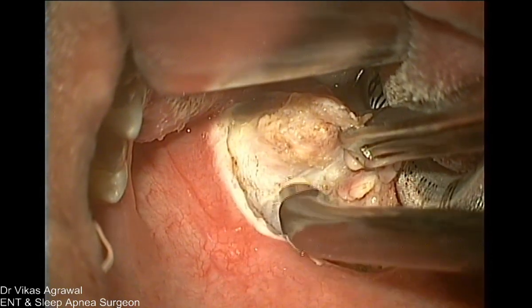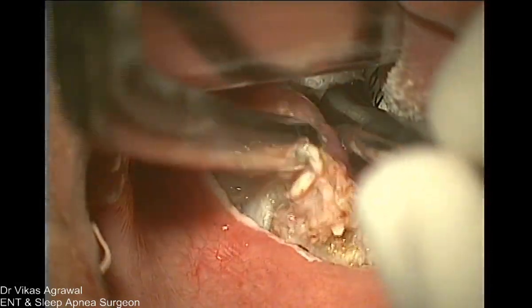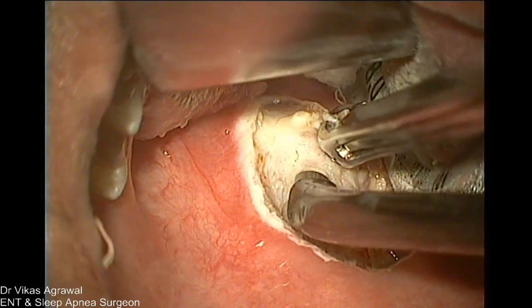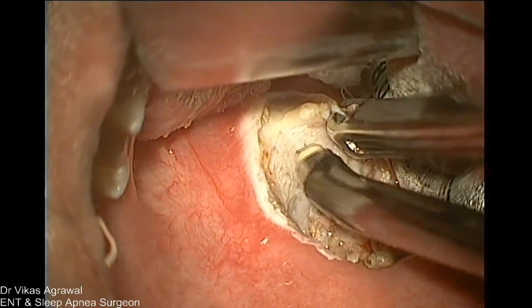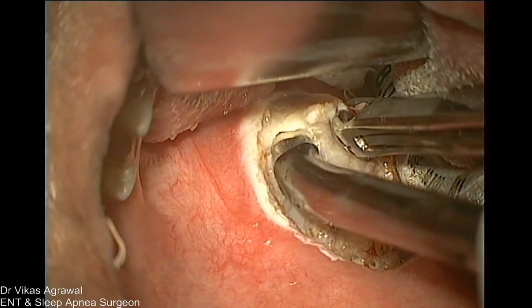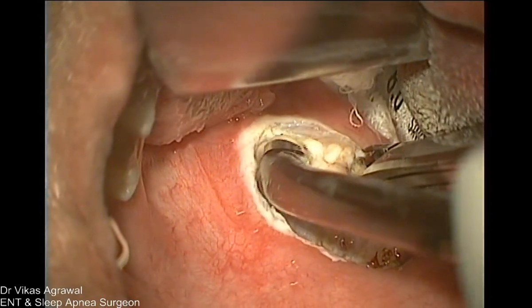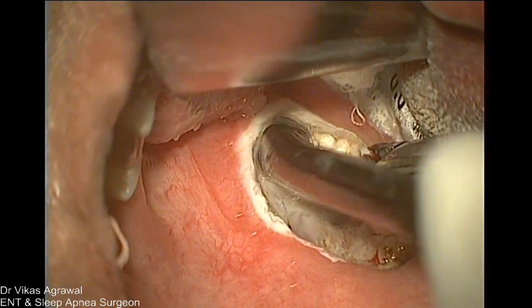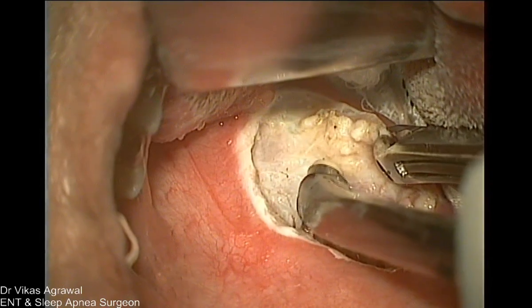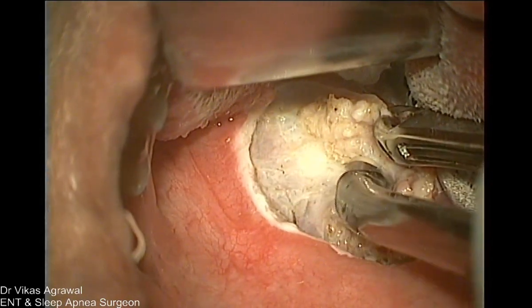Right. So as long as you remain in the fascia, you will not get any big vessel. You will not get much pain. The moment you enter into the muscle, there will be a lot of pain. So wherever we have cut the muscles, the patient will have pain. Wherever we have not, the patient will not have pain. Now, this is the principle applicable mainly in small kids while doing tonsillectomy with coblation. Now you see, as we go laterally, we have taken out the whole tonsil. Right. And we are opening the tonsil like a book.